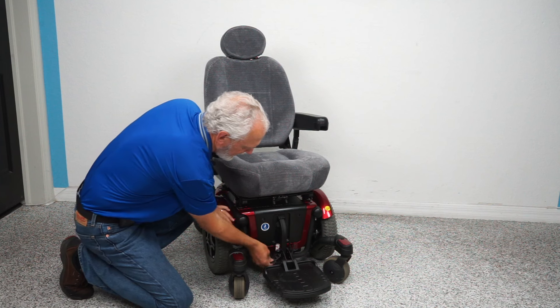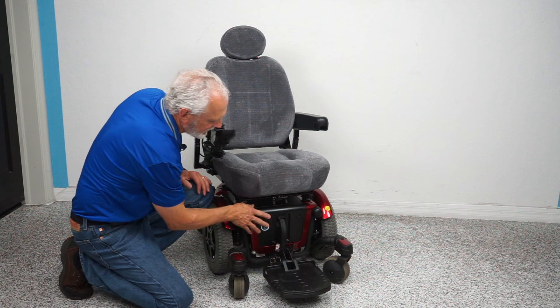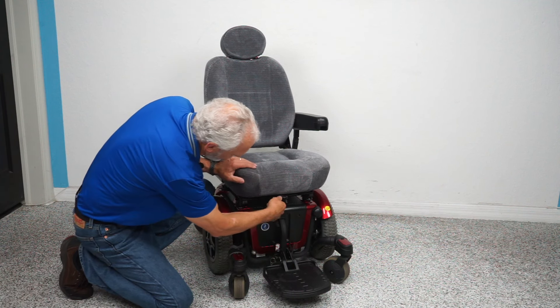On the Quantum chairs, the batteries always come out from the front. There's a pin in the bottom right here — there are two pins in the bottom. You pull those pins out, grab this, the whole front end comes out, and the batteries come out this way.